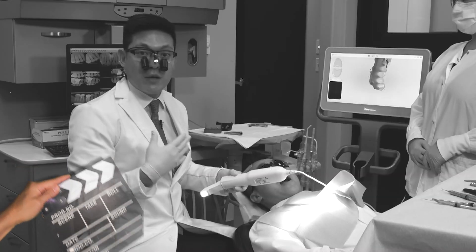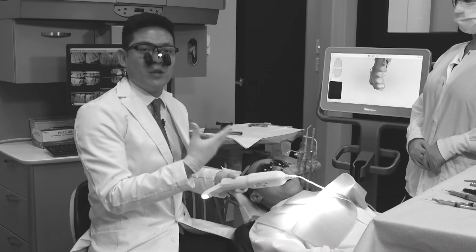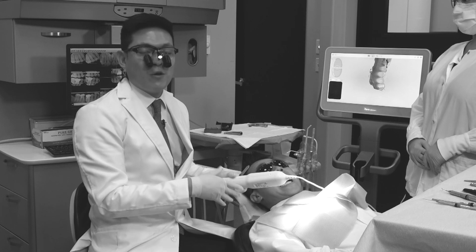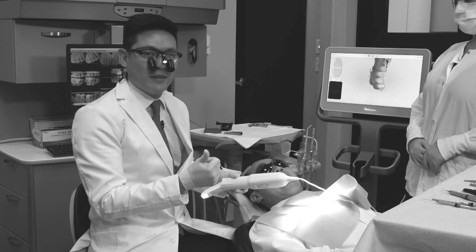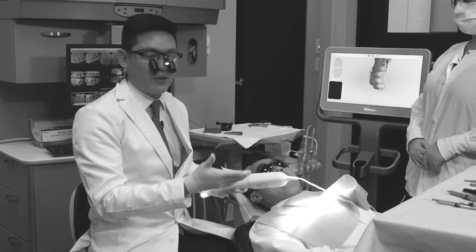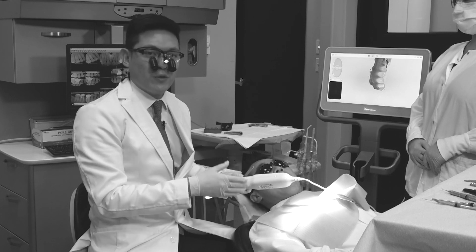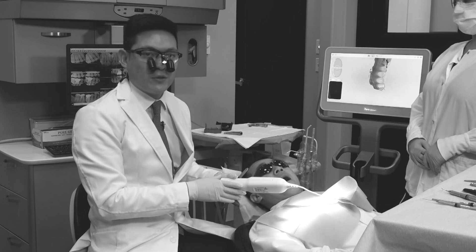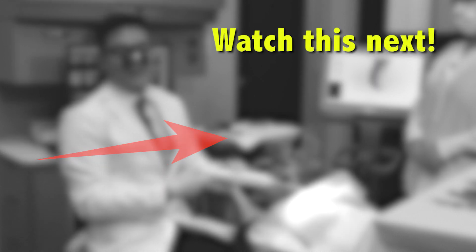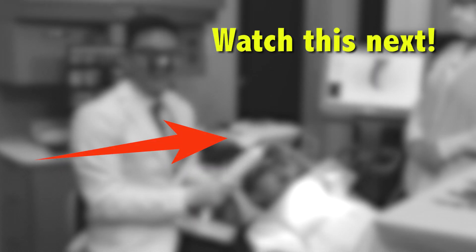That's how we control moisture in a lower posterior situation. Again: suction, dry, making sure the area is dry, then go through your sequence making sure nothing else goes onto the prep during the scan. That way you can achieve an accurate digital impression.